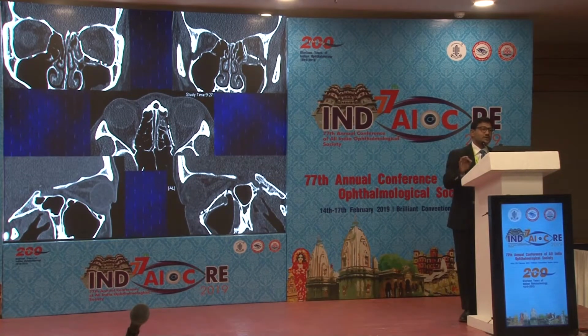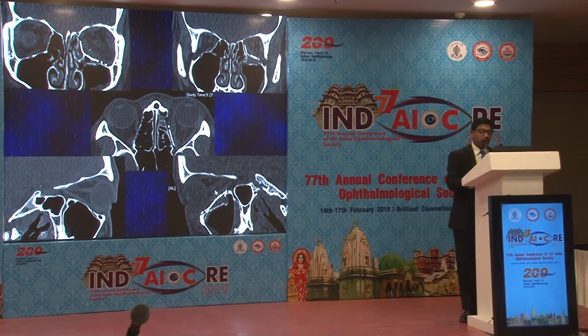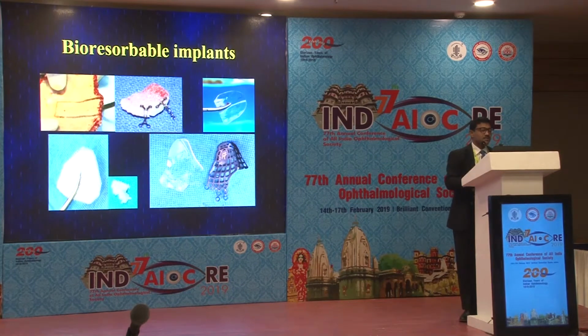Examples are symmetrical, accurate anatomical reconstructions shown over here as well. You can see the medial wall, the floor, the ledge between the medial wall and the floor, and more importantly, on the sagittal cuts, you can even account for that little bulge that you're supposed to see compared to the contralateral orbit. Remember the S-shaped contour rather than sheet implants itself, and of course, leads to patient satisfaction.